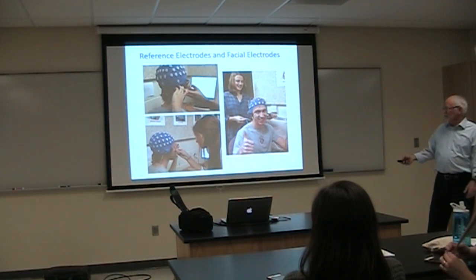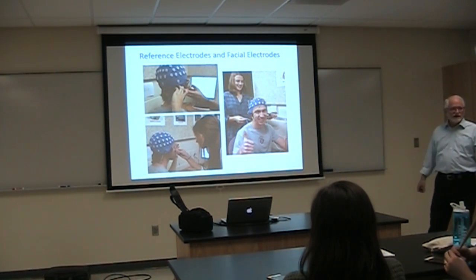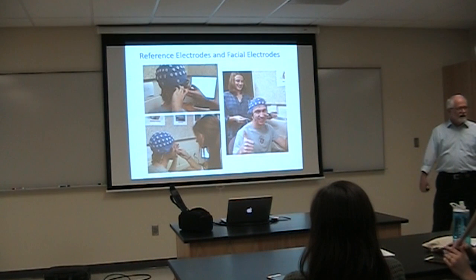Okay, here are some photos of the person being fitted with the cap, electrodes put on. Why do you think we need these facial electrodes in addition to the EEG electrodes?